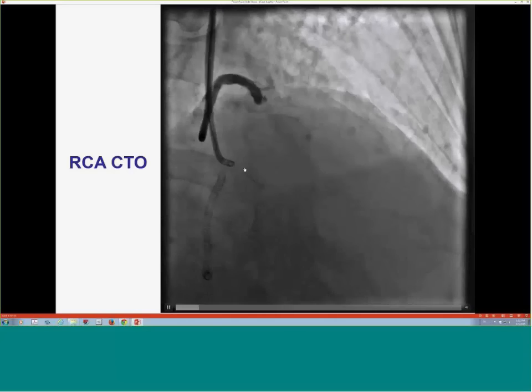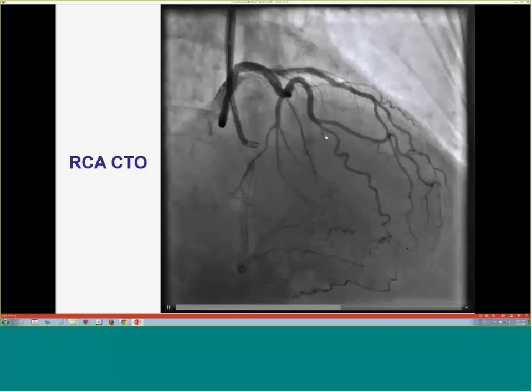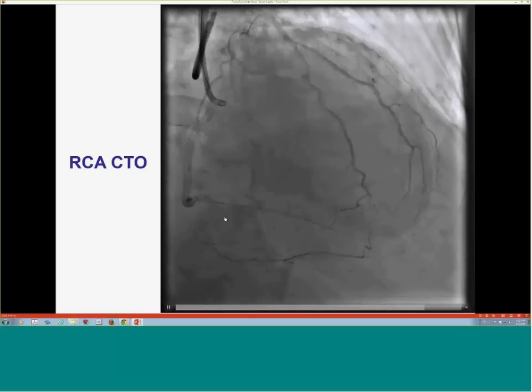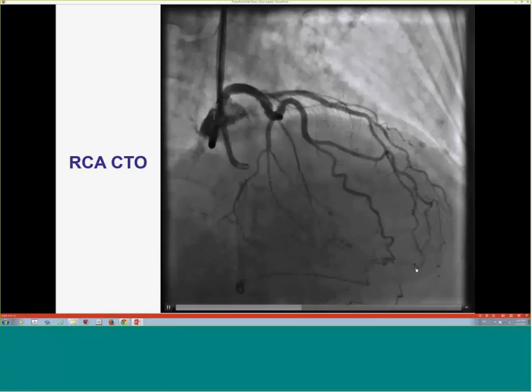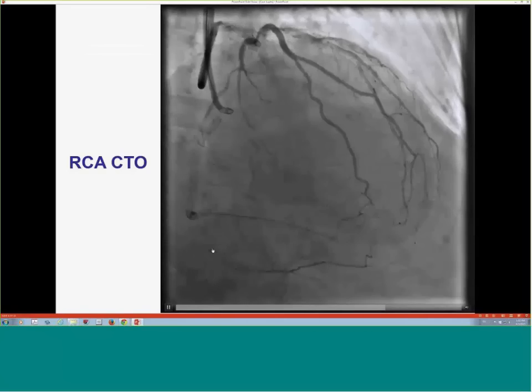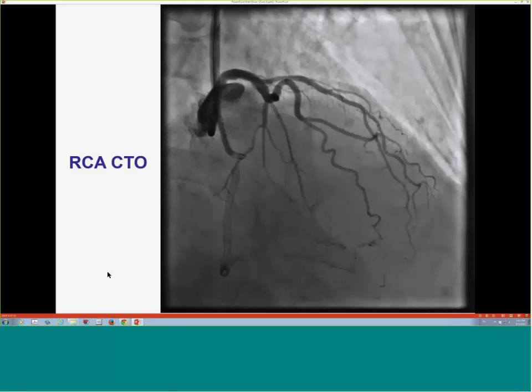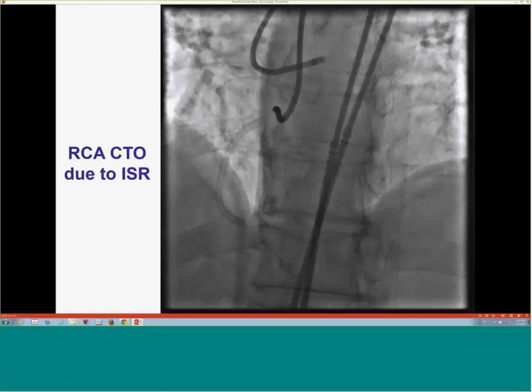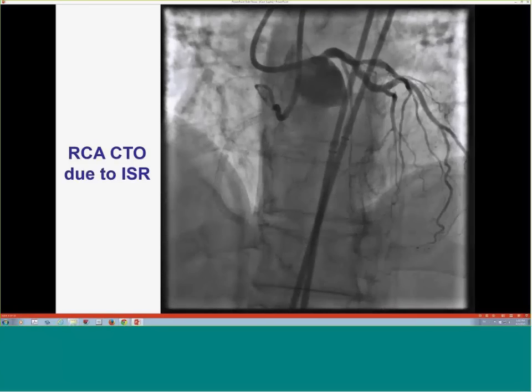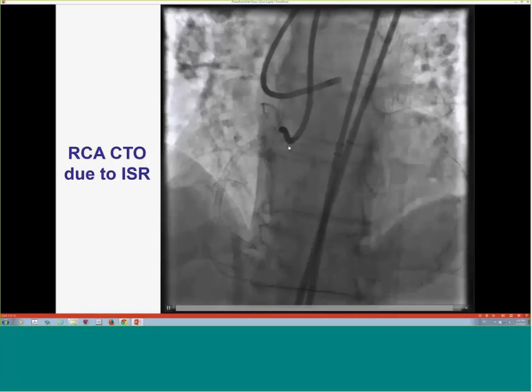And we do have some septal collaterals. There's a septal collateral coming and connecting down to the PDA. Not the best. There's an epicardial collateral, which sometimes can be confused for septal, that goes all the way and gives an acute marginal coming all the way to the mid-right coronary. So in any case, it looks like a fairly challenging case. Anyone has any thoughts about how to tackle this patient? Again, you can see here, literally virtually no vessel in the proximal part.